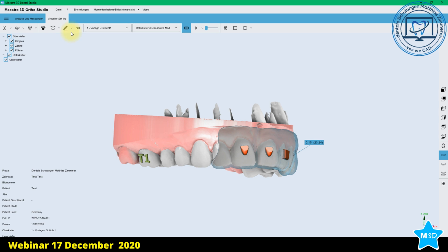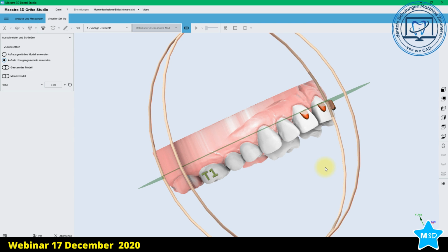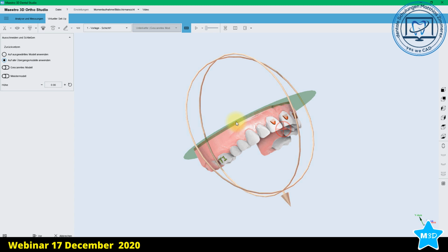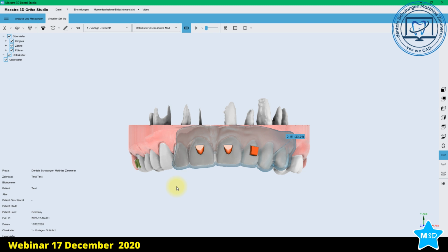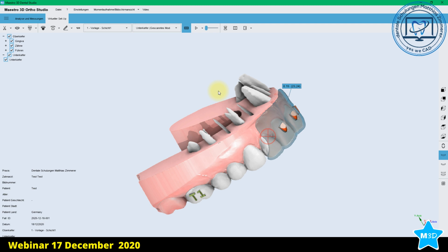This is the second option you can do. If you say now it's too high, you can now cut it easily. If the jaw is complete, I think this isn't the best solution. It doesn't work the whole time. But if it's a plain cut and you say the models are too high, then you can make it a little lower.